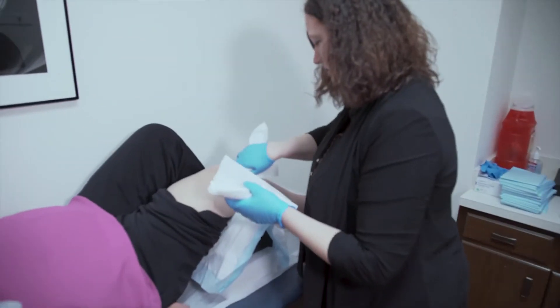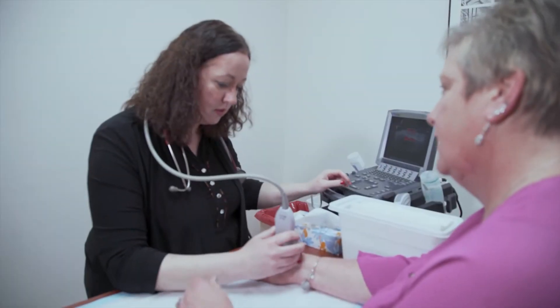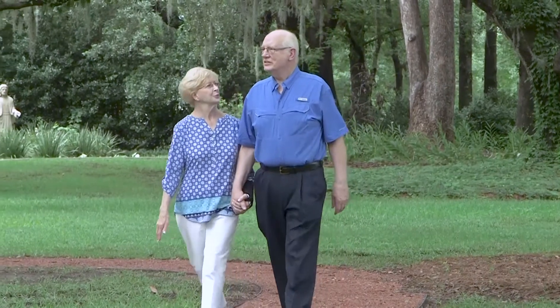It also can help direct the needle when we want to perform a joint injection, and the patients can have a normal life without any deformities and destruction of the joints.